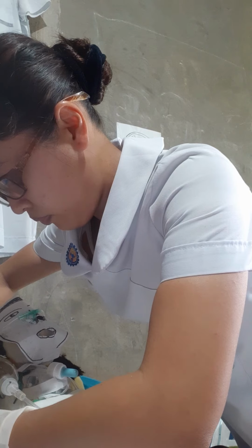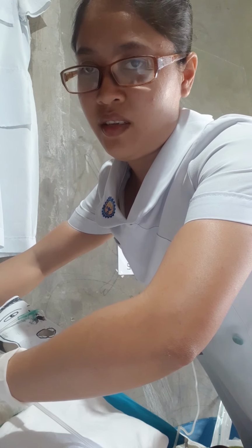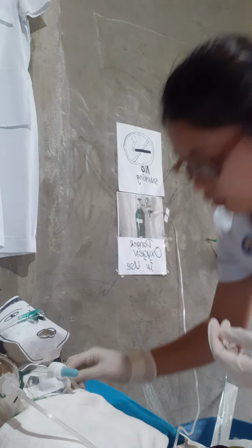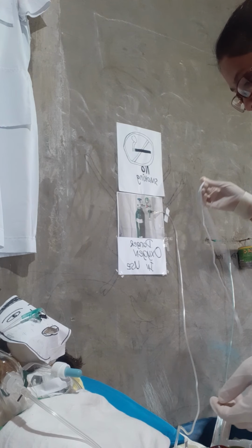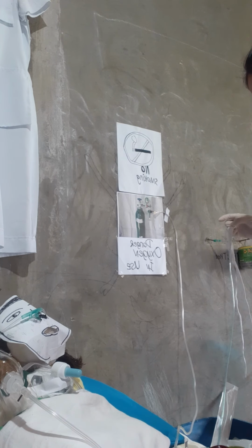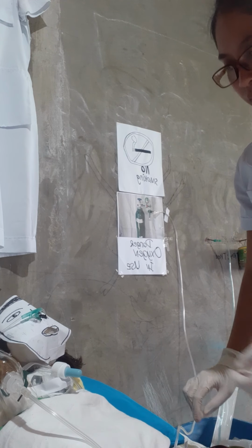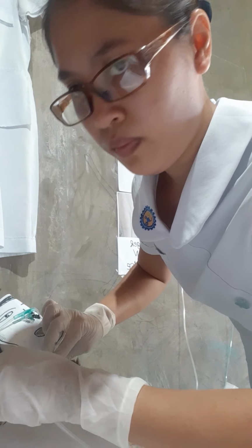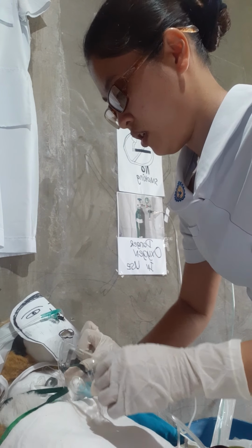Afterwards, we need to check if the patient can reflex back. Then if he can, we need to remove the old ties and discard them in the proper place. And after that, we need to return the oxygen device.